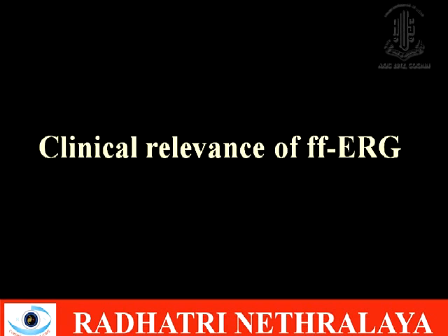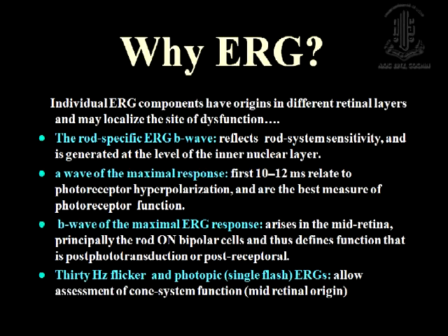So I'll quickly go on to the clinical relevance of full field ERG. Now, why do we need full field ERG? To answer this gentleman's question, basically you must understand that full field ERG is a global retinal response, okay? But still the individual ERG components have origins in different retinal layers, and hence if we accurately analyze which component is involved, we may be able to localize the site of retinal dysfunction.